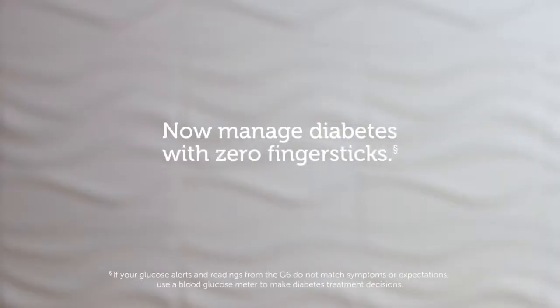With the Dexcom G6, you can manage your diabetes with zero finger sticks — yes, zero. The Dexcom G6 allows you to make treatment decisions based on the glucose number you see on your smart device or receiver.